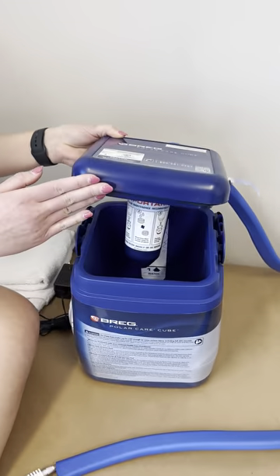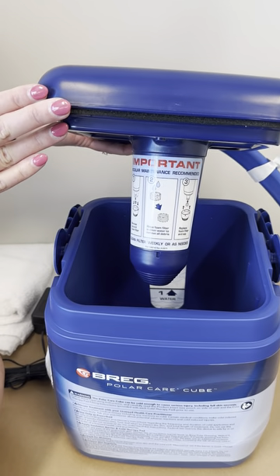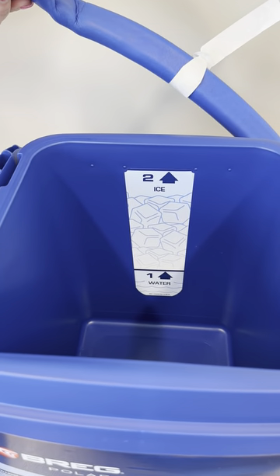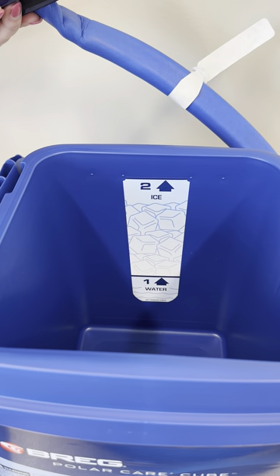You'll then take the lid off of the chest, and there are step-by-step instructions to set up the filter. You may then fill with water and ice. You can also use many frozen water bottles in this setting as well.